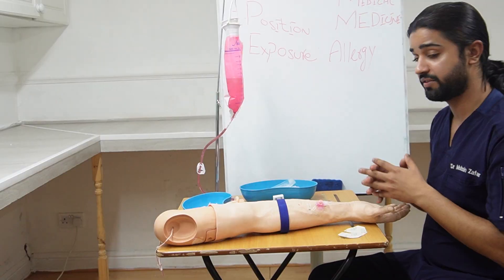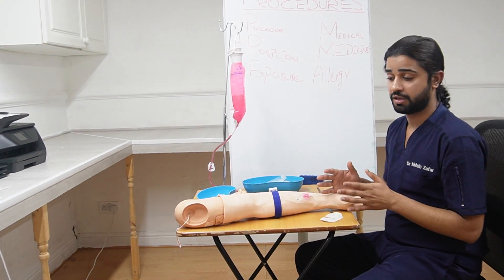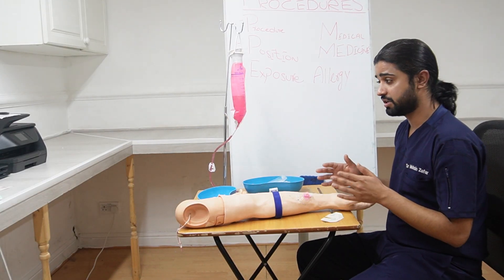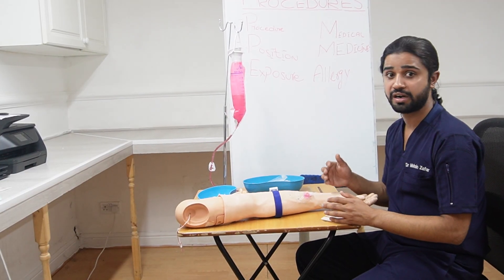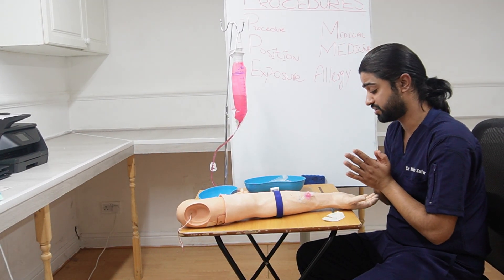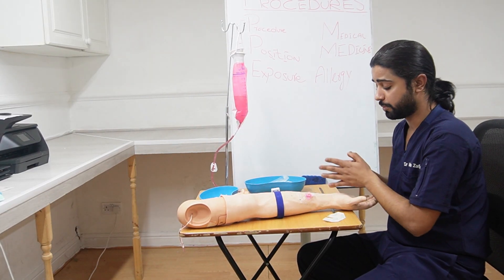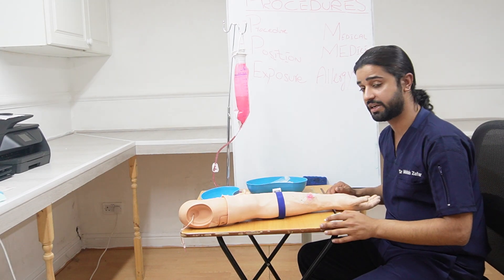After that, we are done with the procedure. Thank the patient and let them know: if you feel any fever, discharge, or bleeding from the wound site, or any redness around where we have inserted the cannula, please let us know. This is all for the IV cannulation. Remember to keep your table tidy at the end.